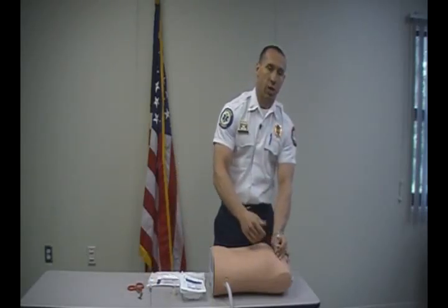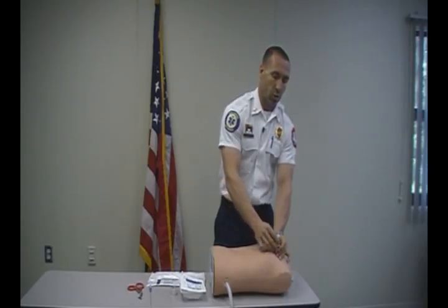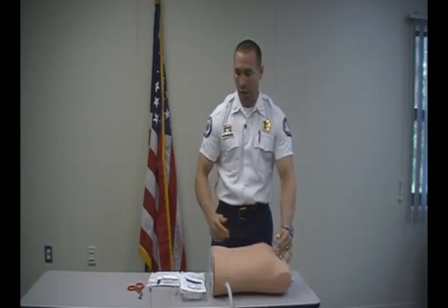At this point you should see clinical signs that your patient is getting better. They should be breathing easier and your pulse oximetry should start to come up. At this point it's a matter of just securing it.